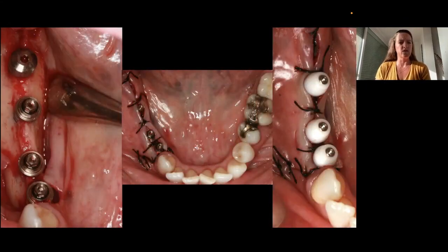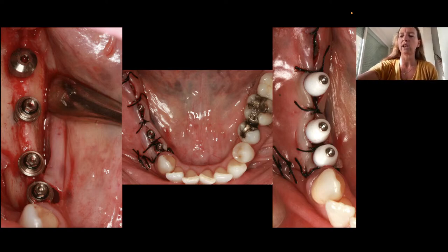And this is where it is crucial also to have implants that are also thinner, like the narrow platform. So you can see here, I placed implants in the premolars and the molars, all of them, and we can see exactly the distance between all of the implants. So this is very important that you have always in mind the distances, so that you can have in the future a perfect good healing of your soft tissues, but also of the hard tissues.